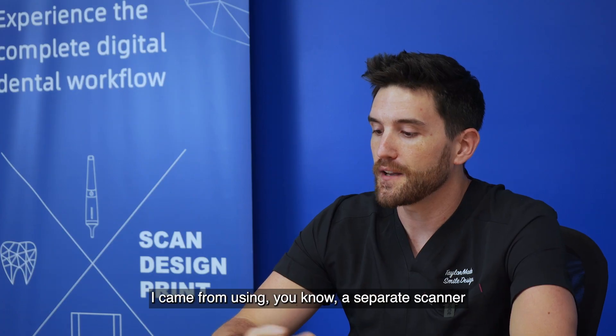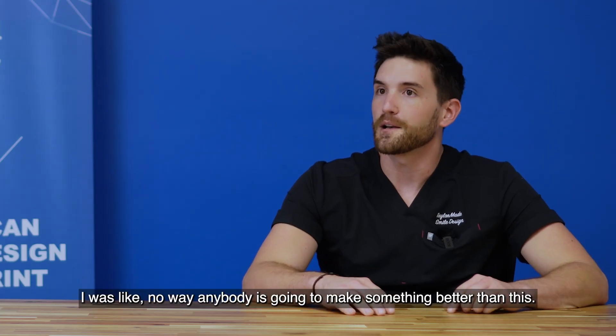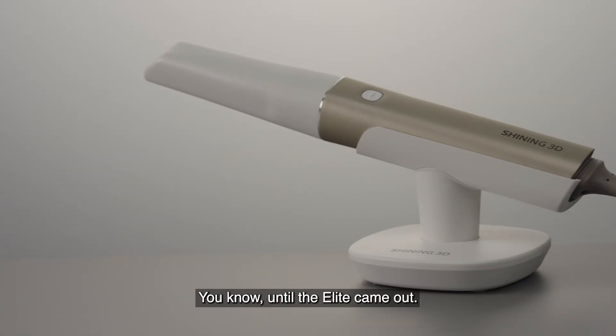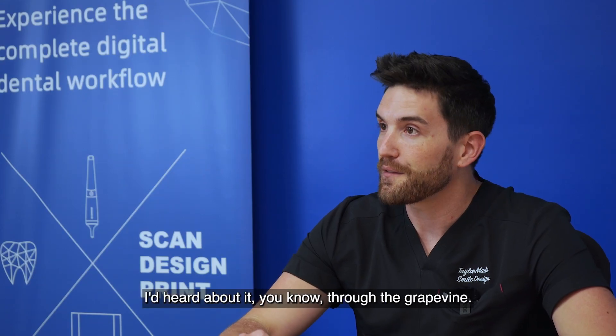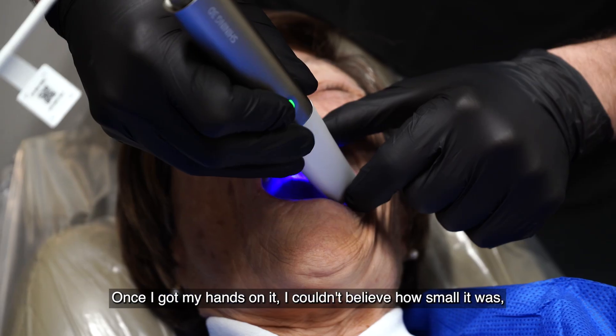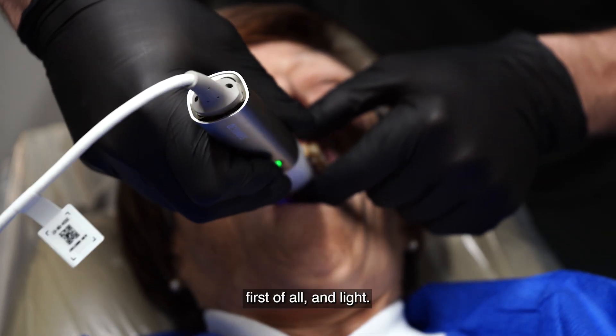I came from using a separate scanner and I thought there was no way anybody's going to make something better than this — until the Elite came out. I got to see it firsthand. I'd heard about it through the grapevine. Once I got my hands on it, I couldn't believe how small it was, and light.